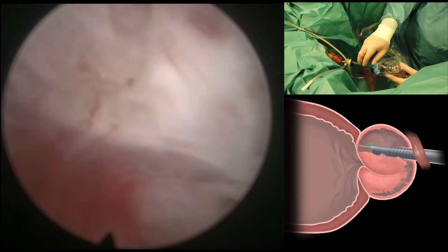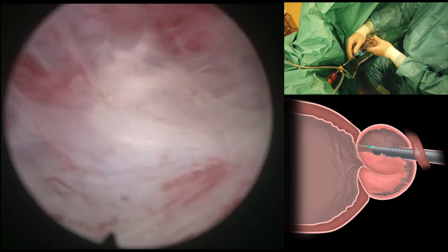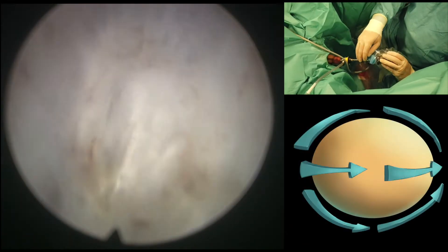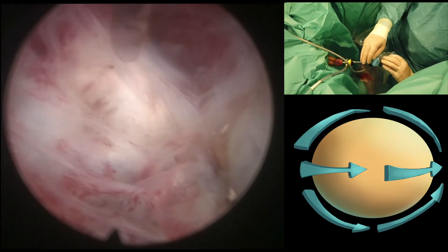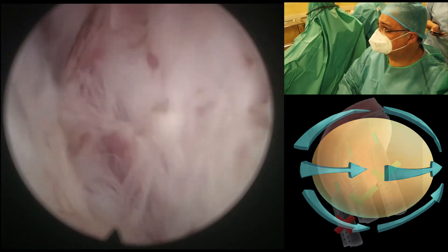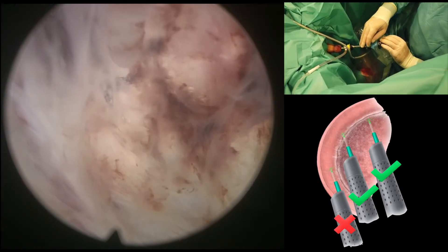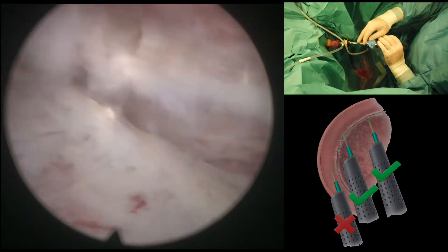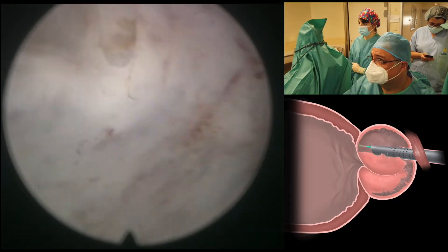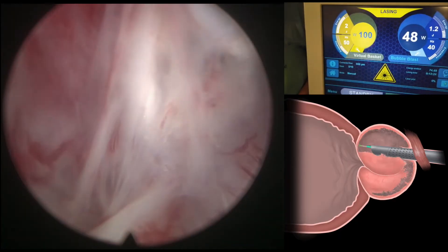The wonderful aspect of this technique as well is that we are irrigating a very small space, and the irrigation of this small space is going to provide us with excellent visibility throughout the procedure. Keep an eye on the graph on the lower right side of the screen — it represents how we have to change the aiming of the laser as we deepen our dissection. Initially we can fire against the line of attack; we should never fire against the capsule. But as we turn around the angle of the adenoma, we have to start pointing our laser a little bit more close to the adenoma.